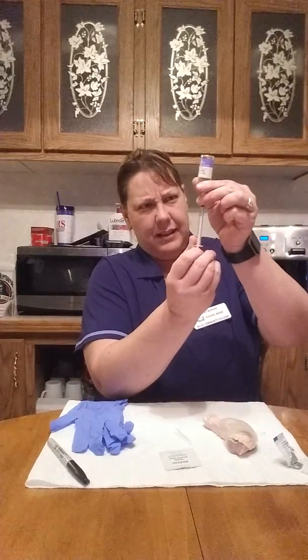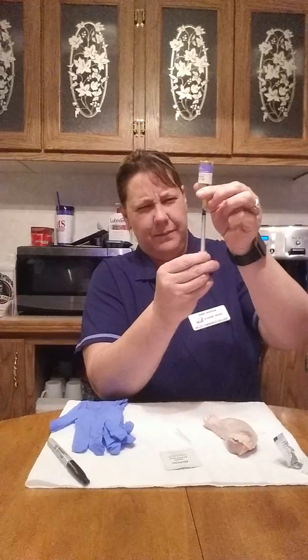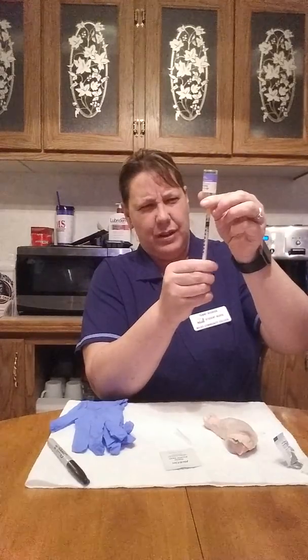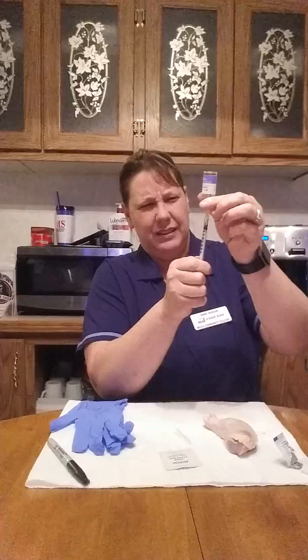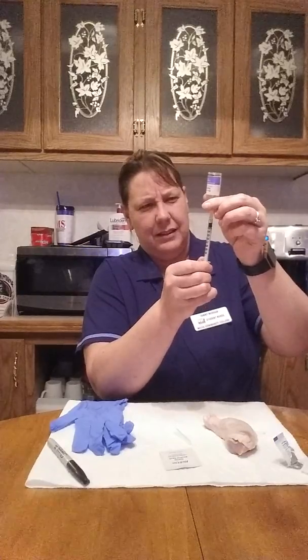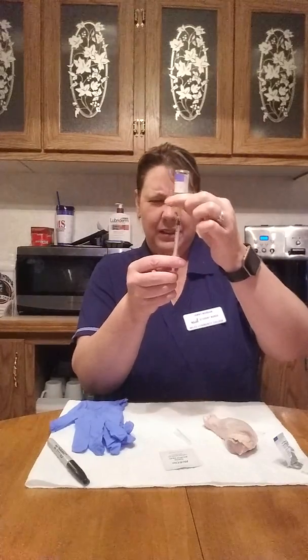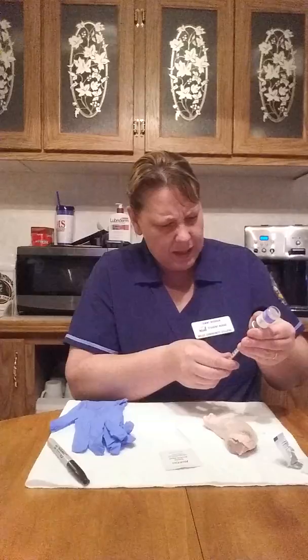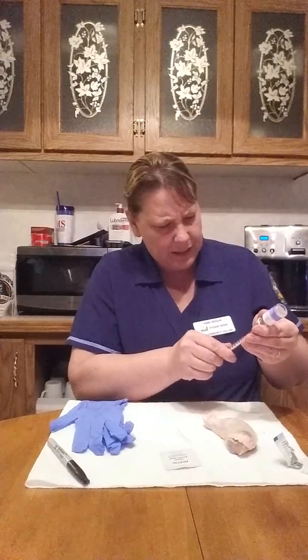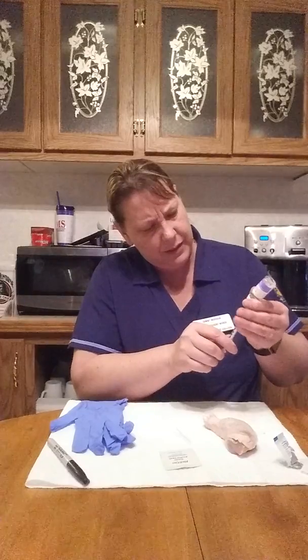And once I've done that, I'm going to go ahead and draw up the medication, trying to make sure we got no bubbles in there. And again, tuberculin, I just want to administer 0.1 milliliters.